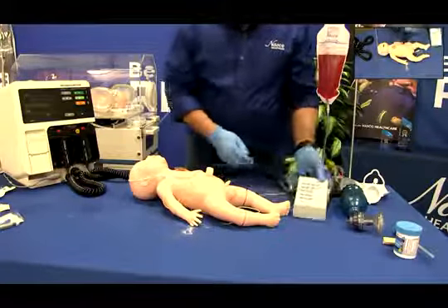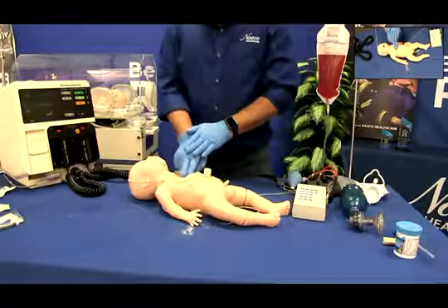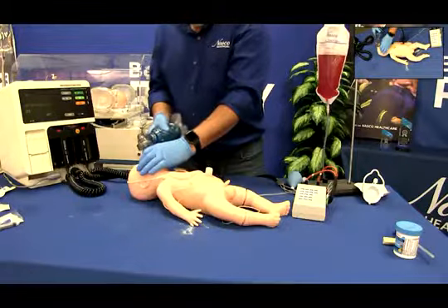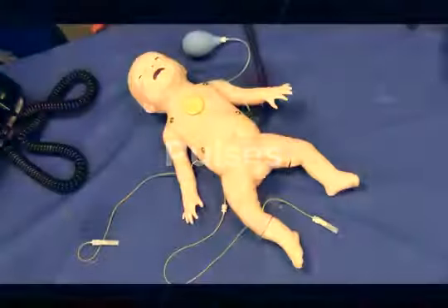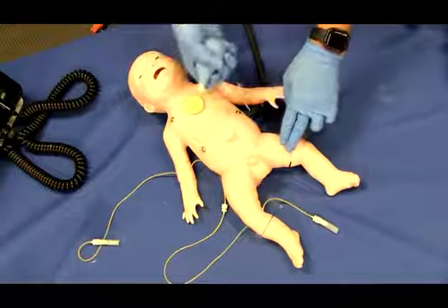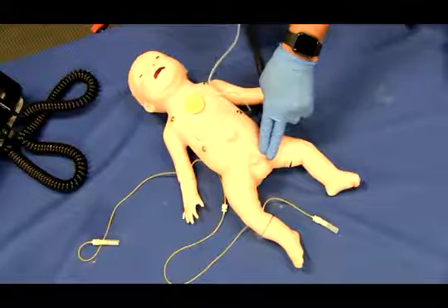CPR may also be performed on C.H.A.R.L.I.E. Follow all local or national CPR standards for infants. Pulses. To perform a pulse check on C.H.A.R.L.I.E, gently pump the inflation bulb to activate the pulses as desired in any of the 7 functioning pulse sites.